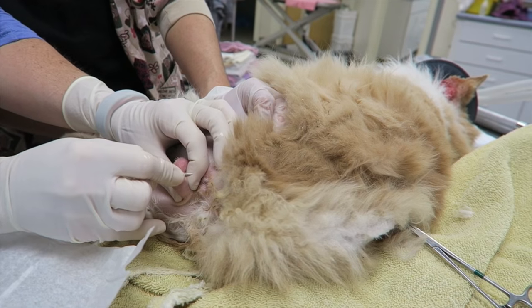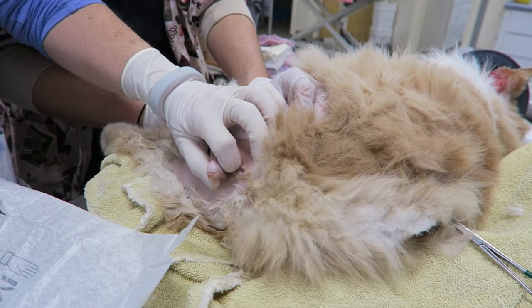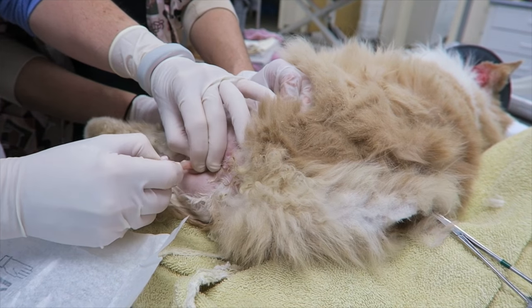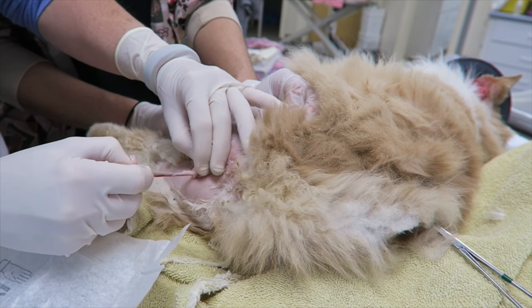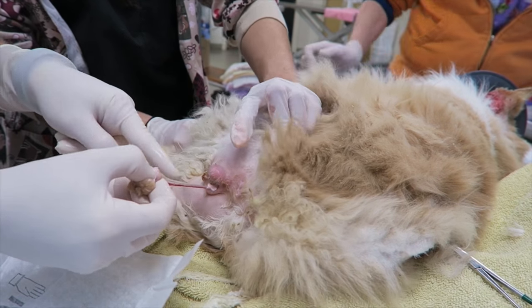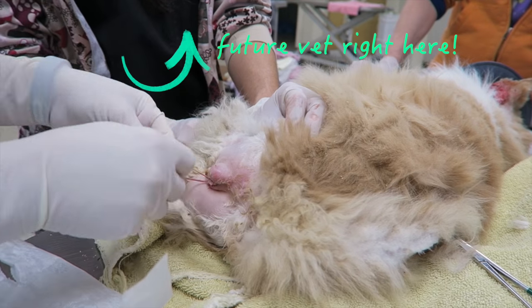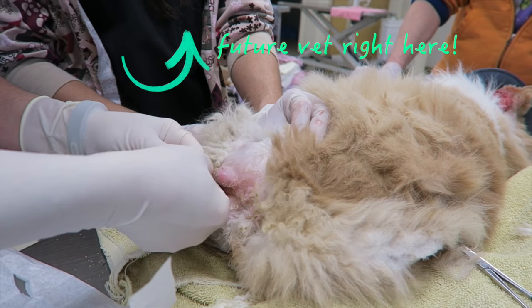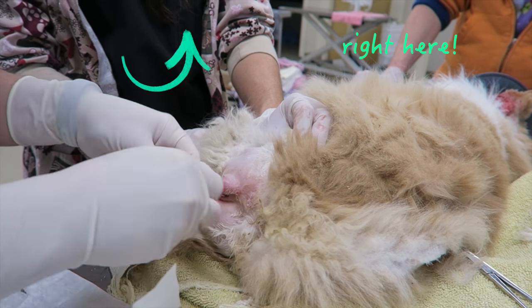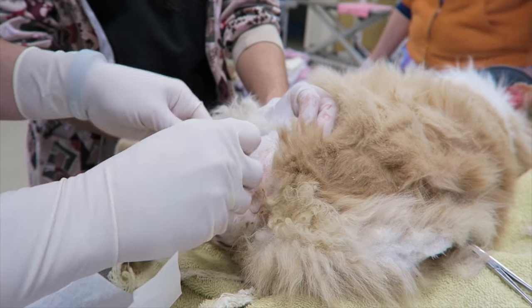Take it. Cut it right over. Right on top. Pop it out. You still got a minute and a half, but there's nothing coming up on it. So, take the tunic off. So now this is open, because that was the tunic. Cord and the vessel. Okay, and then just tie it. So I got one. Now you can do hand ties. I do hand ties, yeah. So there's one knot.